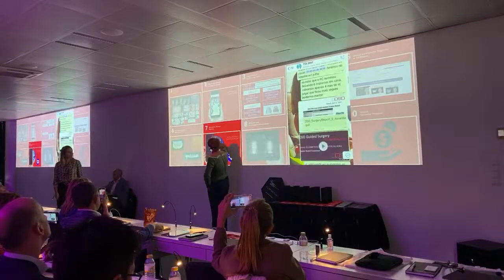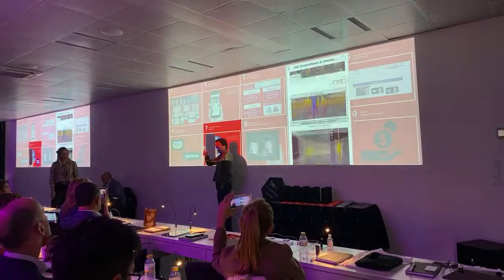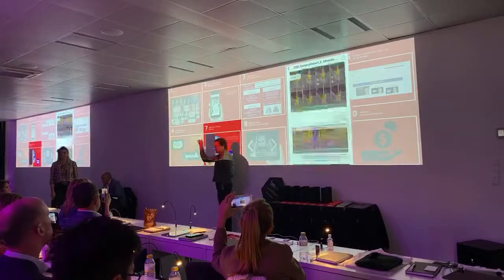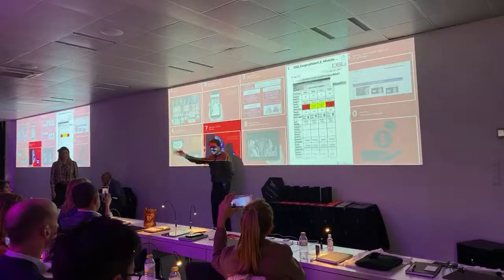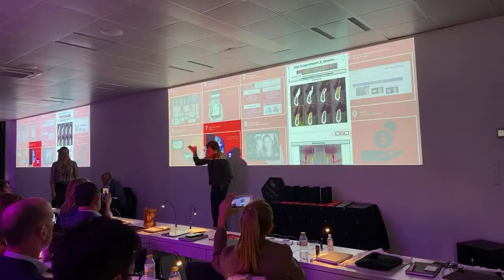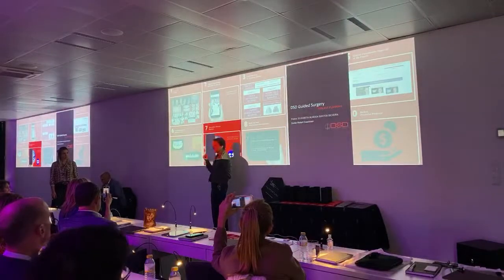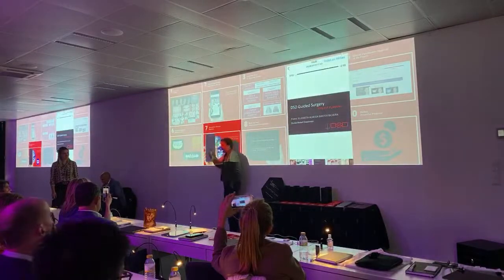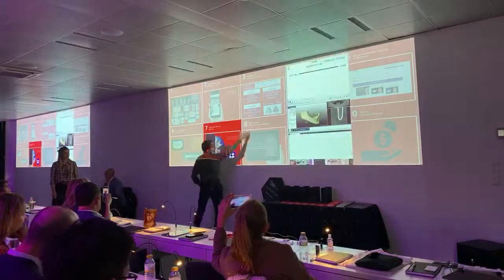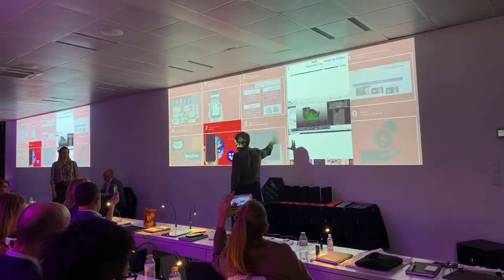And then here, step 7 means looking at the presentation, you as a clinical director, asking yourself the questions that are unanswered, sharing pieces of the videos with the specific doctor so you don't bother them with unnecessary information, straight to the point, questions to each one of them, getting the feedback that may come with modifications. They may say that this initial implant simulation is not what we need to do, and then you change the strategy completely.